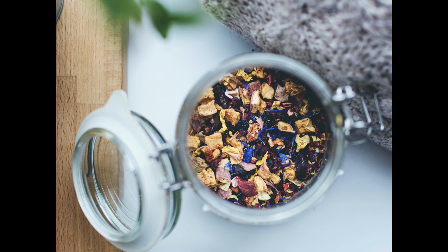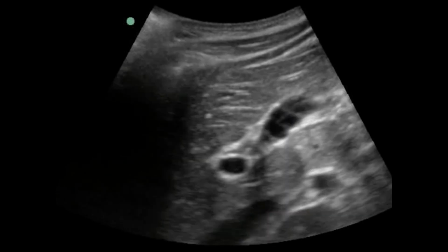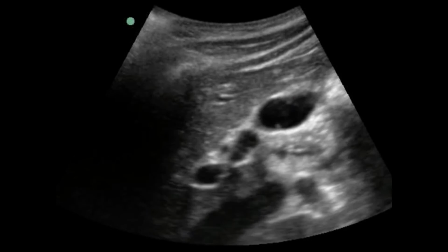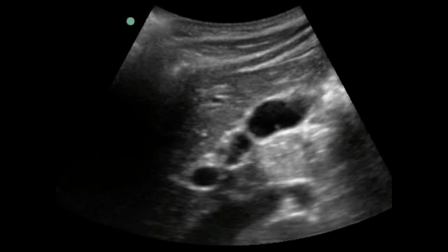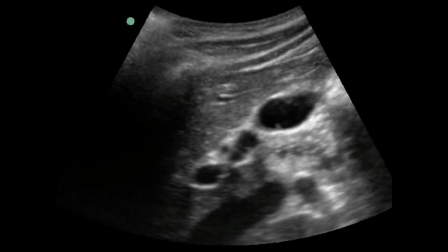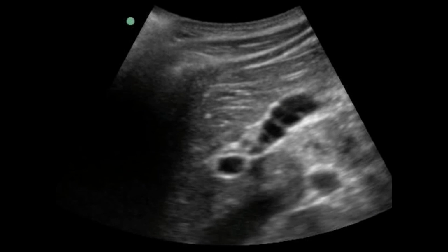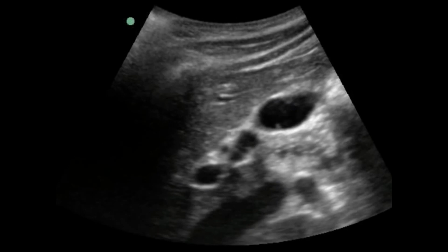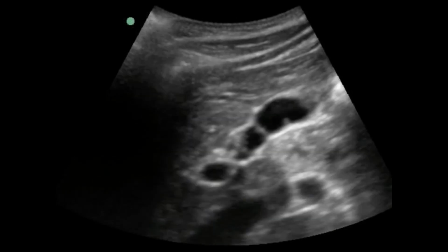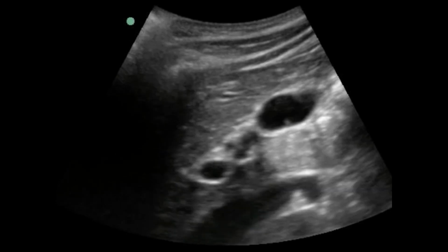So a few extra tidbits, a bit of a potpourri of ultrasound findings that you'll see here, some other more interesting cases. So again, gallbladder right in the middle. Notice that liver edge. Gallbladder always sits right on that liver edge. So that's where my eyes always track to. These little lines going across the gallbladder are normal variants. These are normal gallbladder folds. You'll see this all the time. This does not indicate pathology.